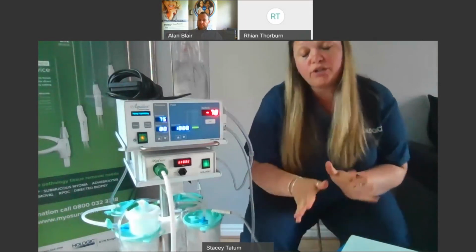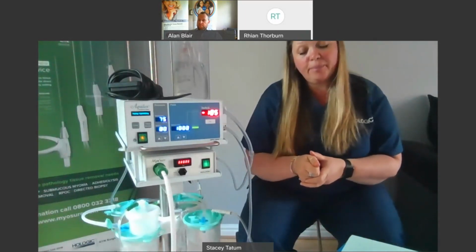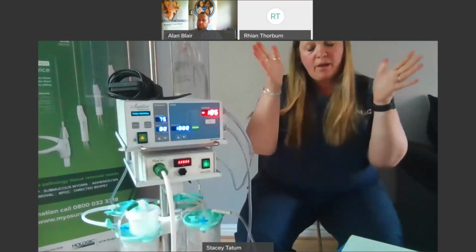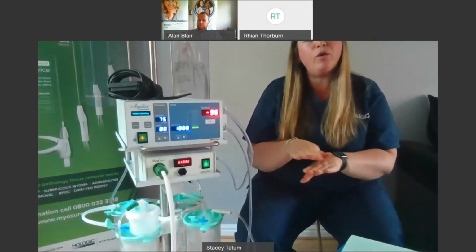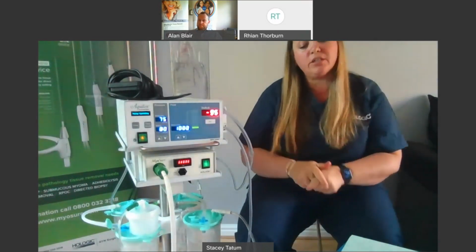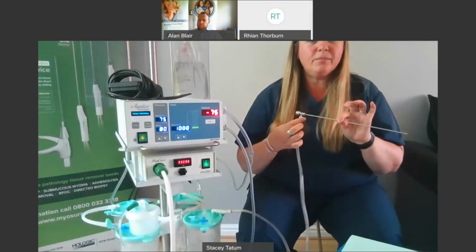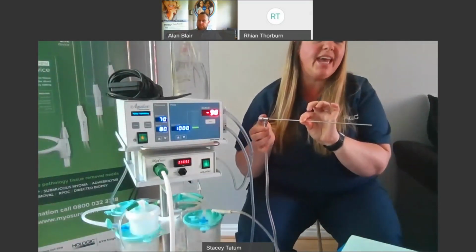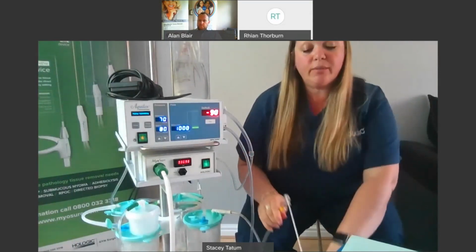Once I check that, I'd go to my under buttocks drape, make sure that nobody's clamped the yellow cap off, make sure that my under buttocks drape is hanging vertical. Sometimes they can have a little fold in them, and then the fluid will sit on top of the fold and can't be sucked back. Make sure that this hasn't come open, and I don't know if you can hear that, but it's now sucking air. If it sucks air, it will leave fluid in the under buttocks drape for you.